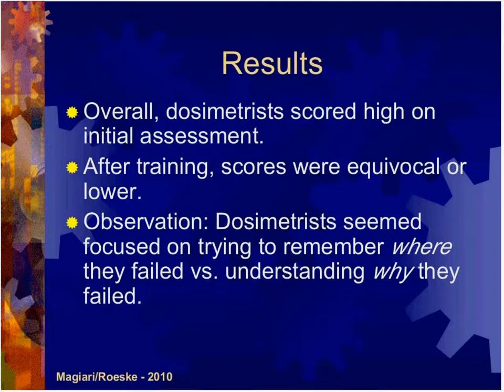So what we've determined is that the best way to do it is maybe not to use the same scan after you've looked at the gold contours versus what you drew the first time. Maybe you try a different scan and see if those scores are the same as what you had before, if not better. Our scores were reasonably good, so we weren't really sure if improvement was necessary, how much better you can really get, and how good is good enough.